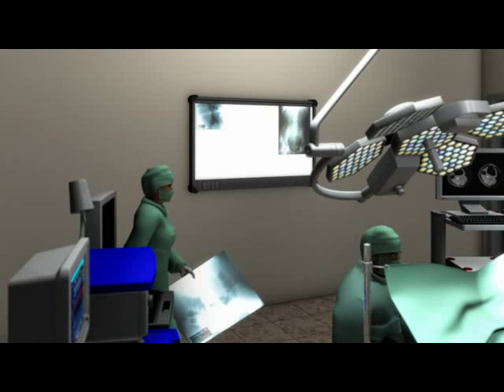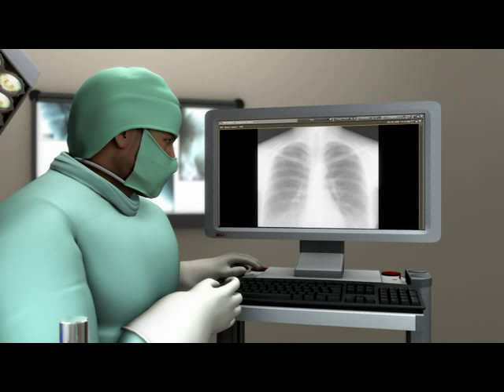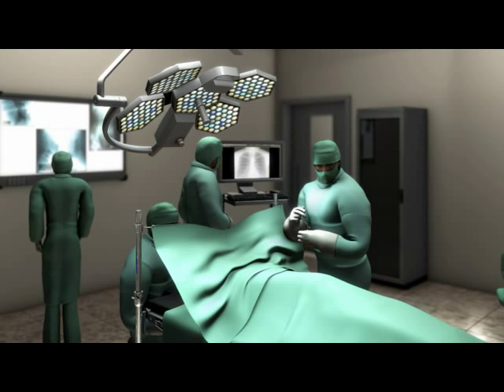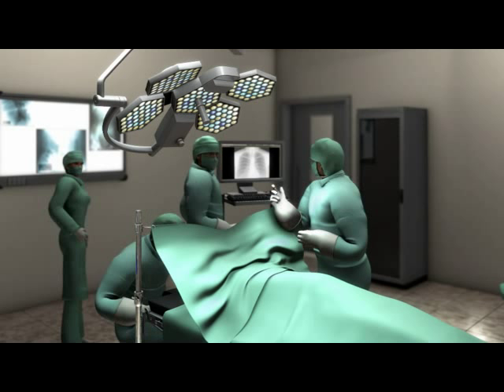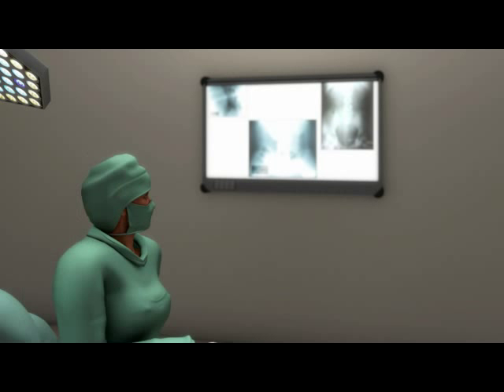Not all data can be set up as a patient folder in the standard operation. Only the CT and X-ray images taken in-house can be assessed via the computer. All the other preparations necessary have to be initiated by the surgeon, and personnel have to carry out instructions manually.